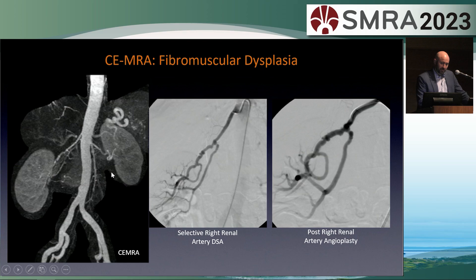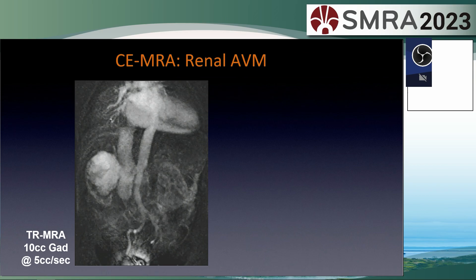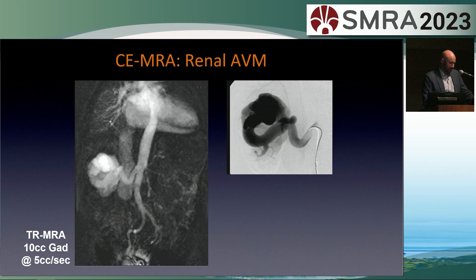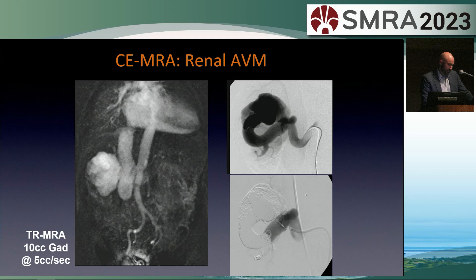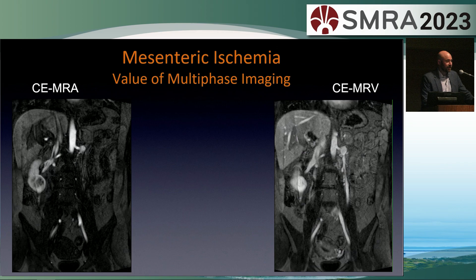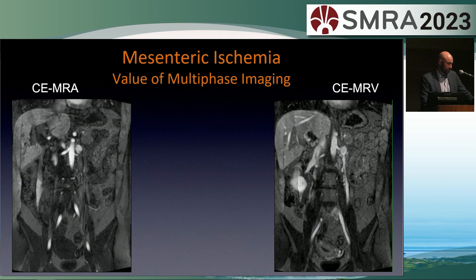A very common referral at Mayo Clinic for contrast-enhanced MR in the abdomen remains renal artery stenosis. This is a classic example of fibromuscular dysplasia in the right renal artery, confirmed on angiography and treated with balloon angioplasty with improved luminal caliber. Dynamic imaging allows assessment of blood flow through the region of interest and can isolate the arterial feeder and draining veins in this patient with a large renal AVM, confirmed with catheter angiography and ultimately embolized with a large number of coils.